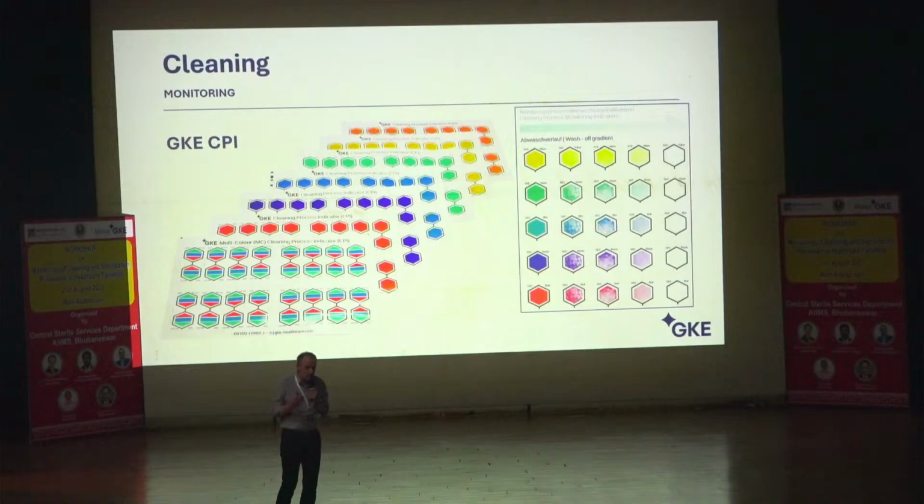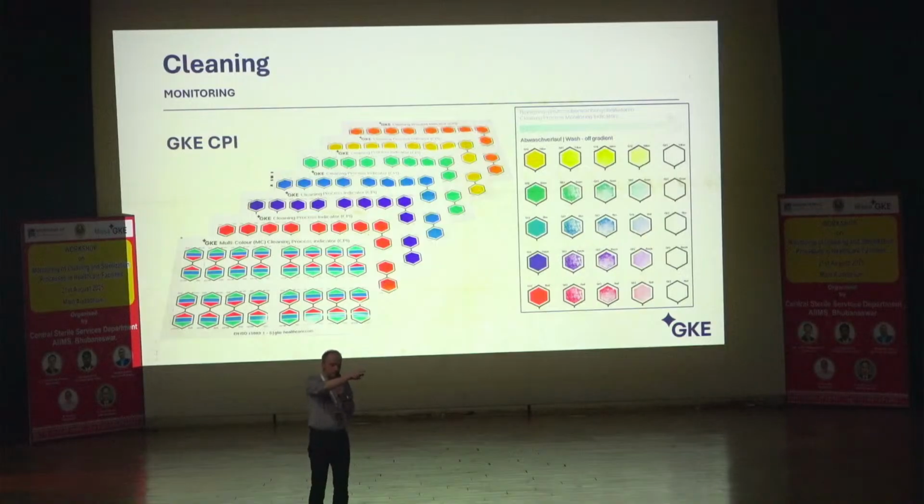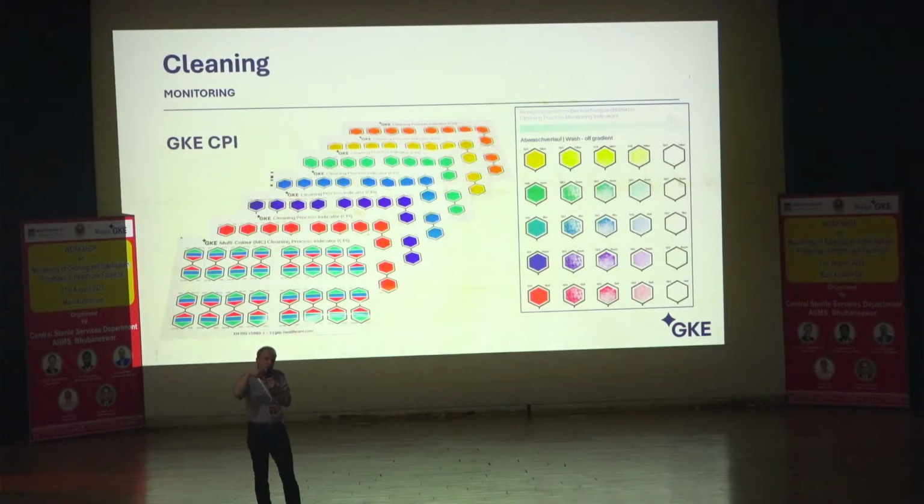But since everybody can apply a process in a way that they think would be best, it can be that you will go for a process with an alkaline cleaner, or you will go for a process with a neutral enzymatic cleaner. You will probably go with a short program with very strong spray. Or you probably will have a program which is very long and very soft to the surfaces of the instruments, and then you compensate with a very long time.